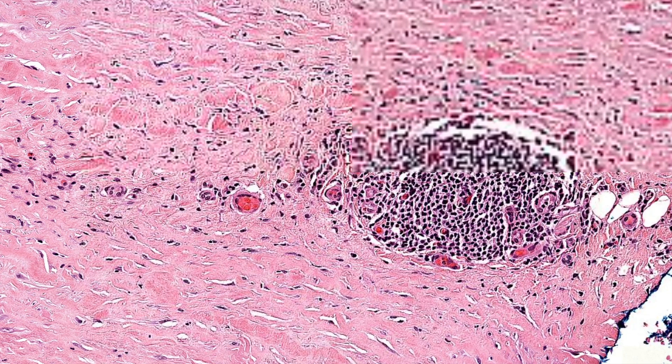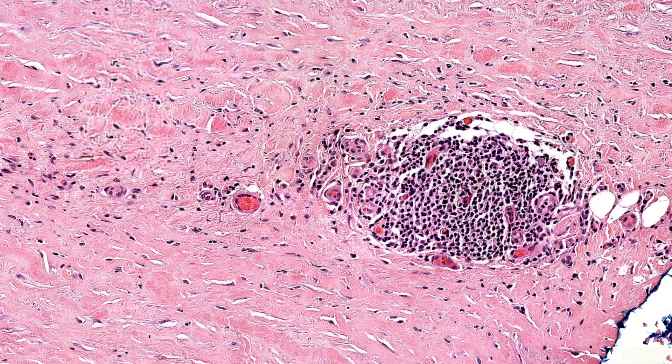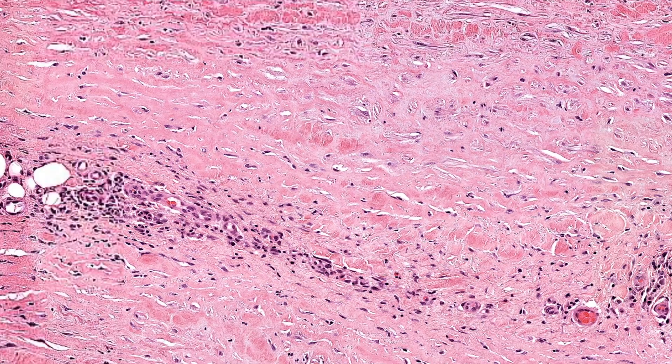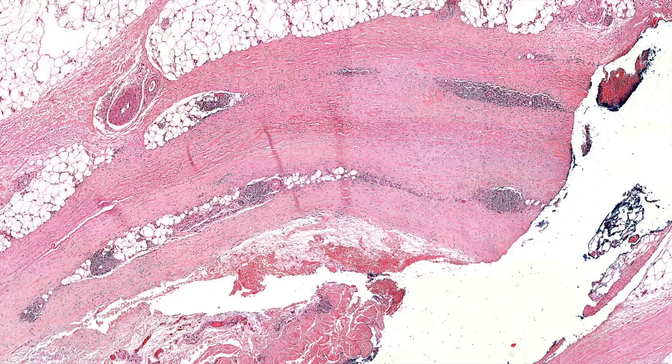Hard to tell on this scan, but lymphocytes — a lot of times you'll see plasma cells in here, and you may or may not see these little guys, eosinophils. So what is it then, Li Ping?